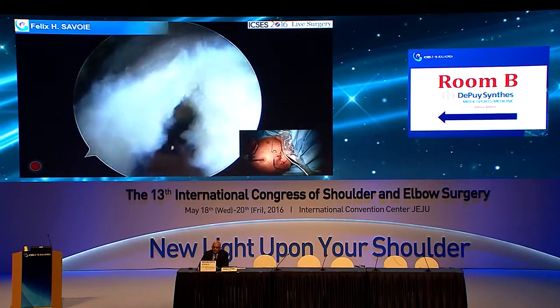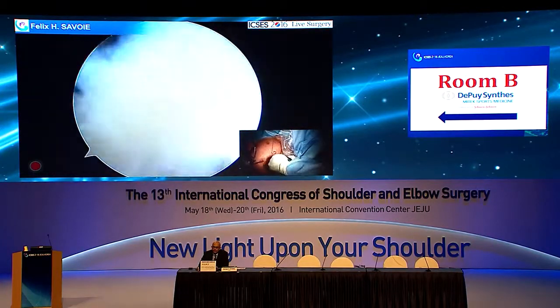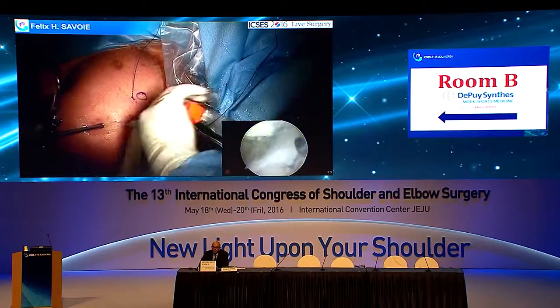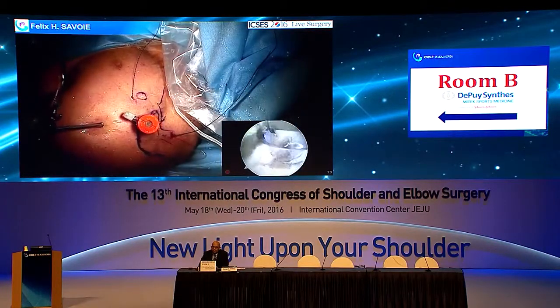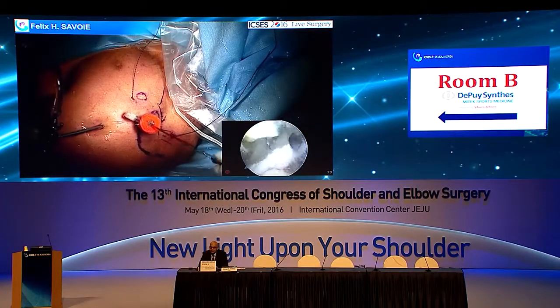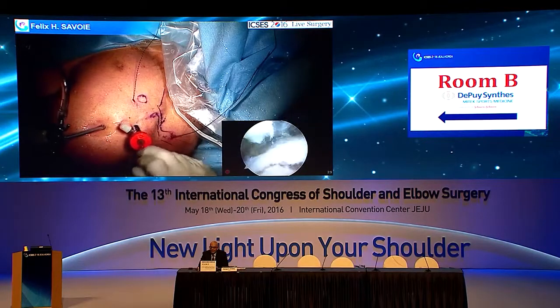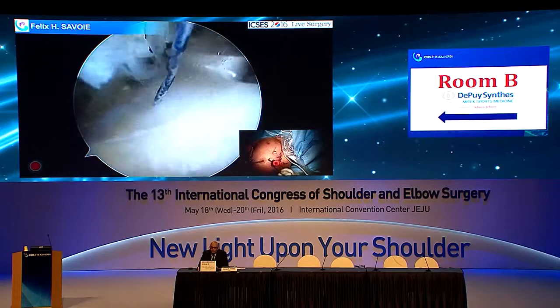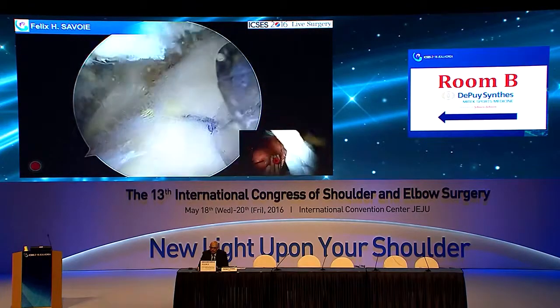So now we'll take our smaller cannula and put it in our superior portal, and we'll take either a crochet hook or a magic grasper and start tying. So, look at a nice crochet hook. Isn't that sweet? That is so nice of them. So you like to tie that medial row first? I am a knot tyer, so I like to tie.